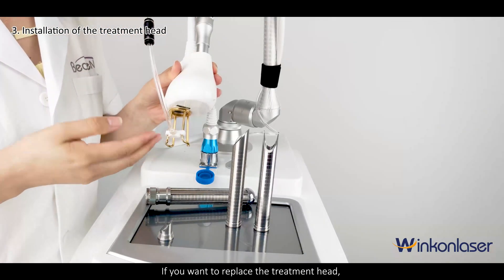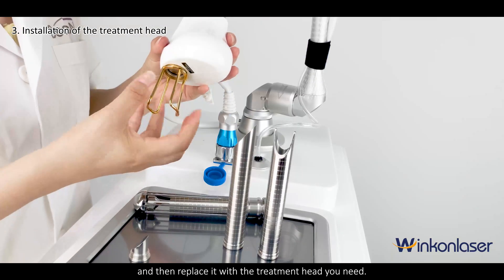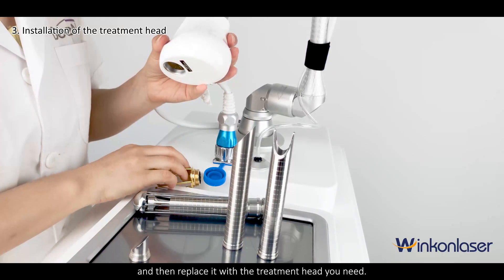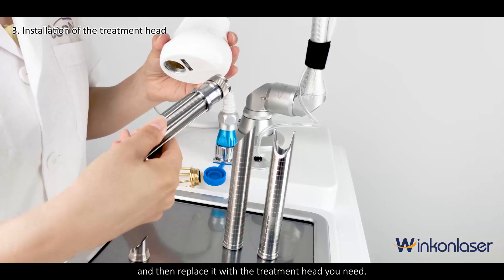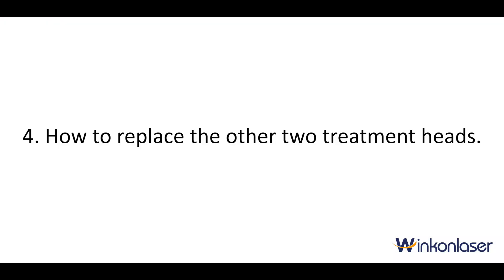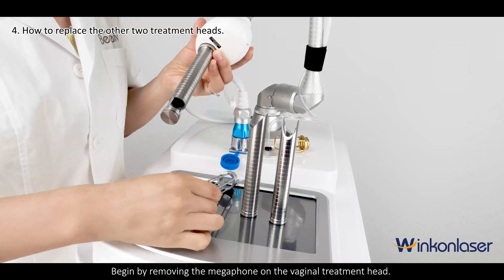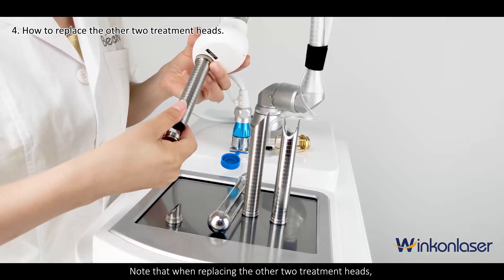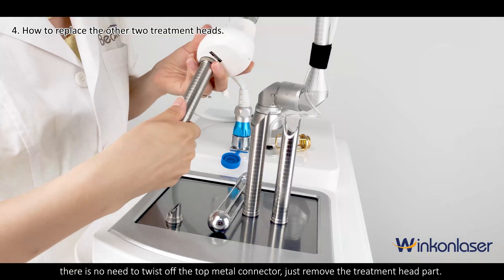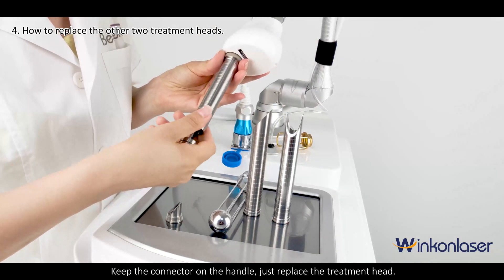If you want to replace the treatment head, you need to unplug the air outlet first. Remove the metal treatment head knob, and then replace it with the treatment head you need. When replacing the other two treatment heads, there is no need to twist off the top metal connector — just remove the treatment head part. Keep the connector on the handle and simply replace the treatment head.